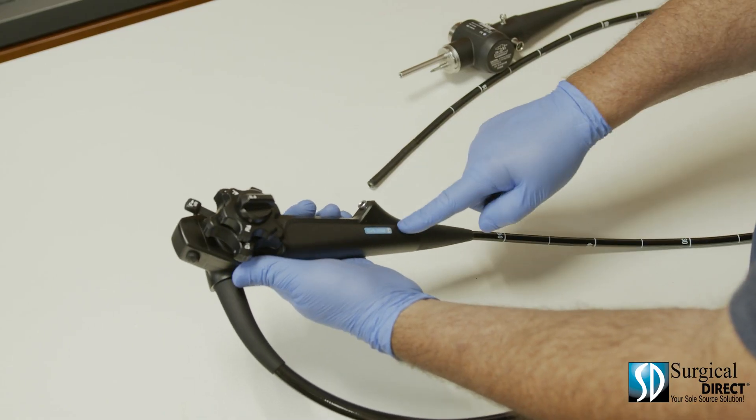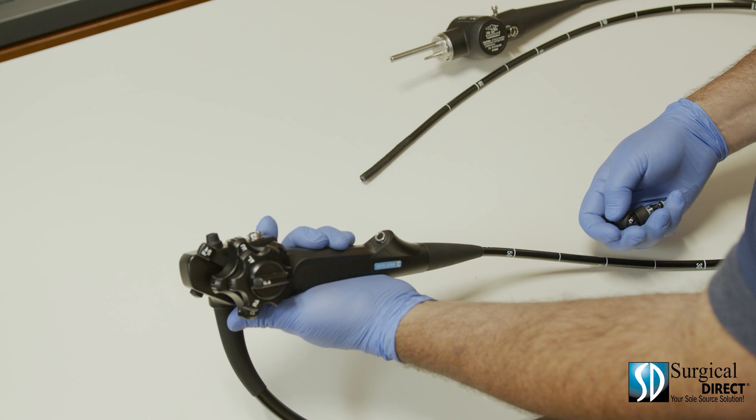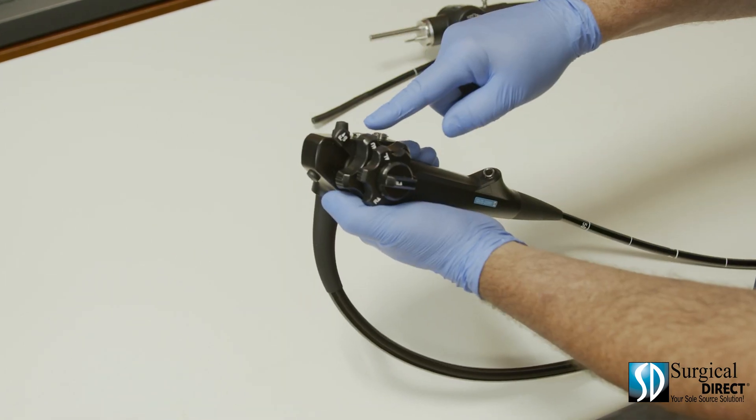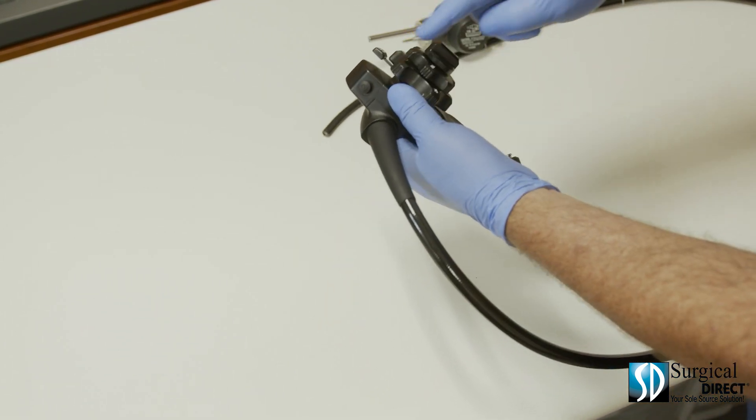This is the control body of the endoscope. It houses the air water channel, the biopsy channel, the control knob, and the video buttons. Button one takes a picture; button two takes a video.